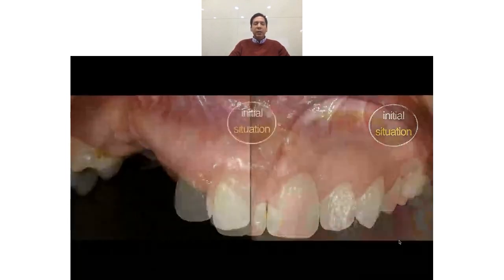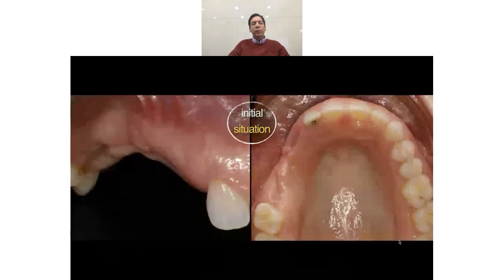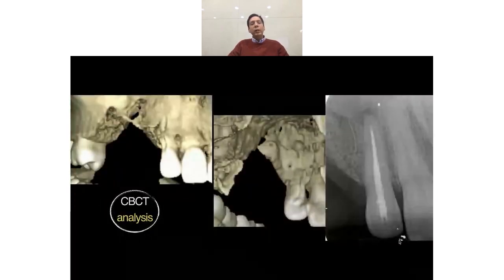I have this case. This was a woman, 31 years old. She's a medical doctor, and she had implants. She had a big infection, big bone loss, and she was referred to me to treat the right maxilla. When we saw the CBCT, we saw that there was a very large vertical defect. We saw the big bone loss, and in the apex of the lateral incisor, we can see here with the cursor a periapical lesion that communicated with the palatal aspect of the bone defect.